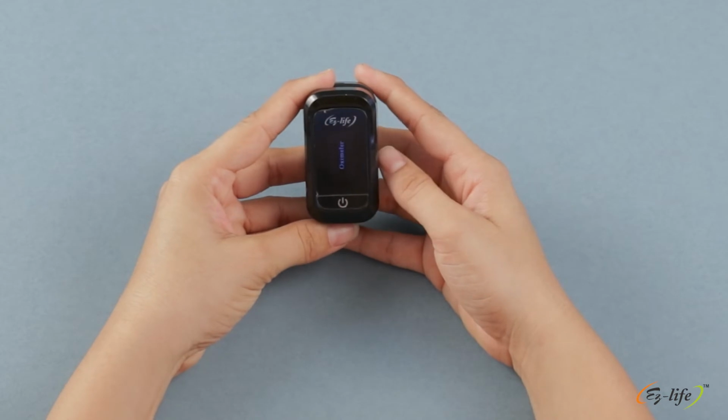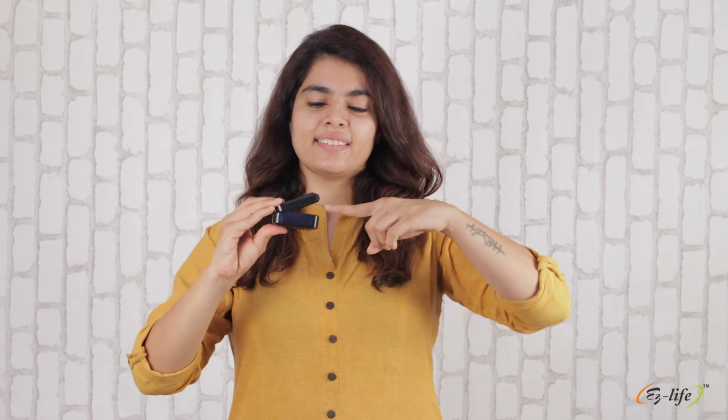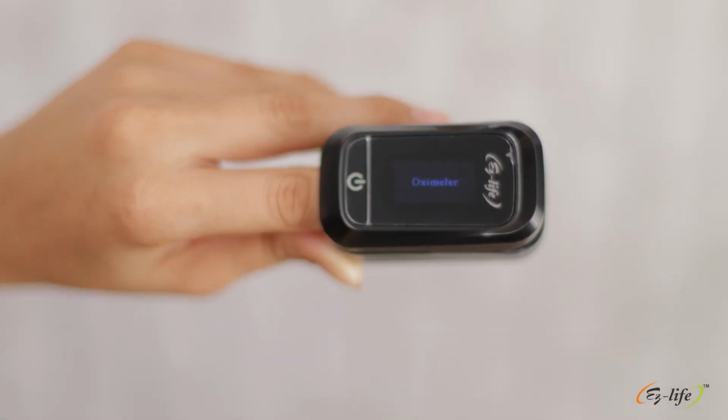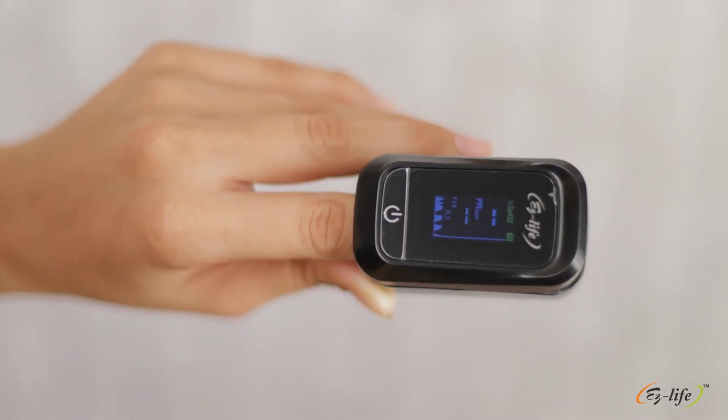Press power button and the device will be on. To measure your blood oxygen and pulse rate, put your index finger from the front side of the device. After placing your finger in a device correctly, press power button on the device. Your device display panel will be started.